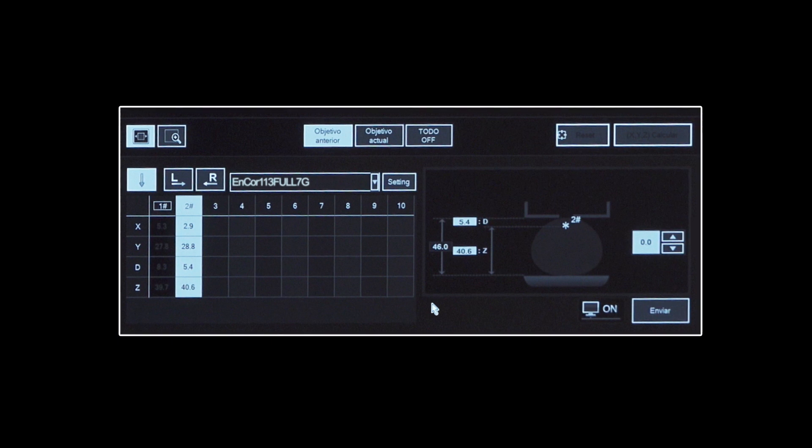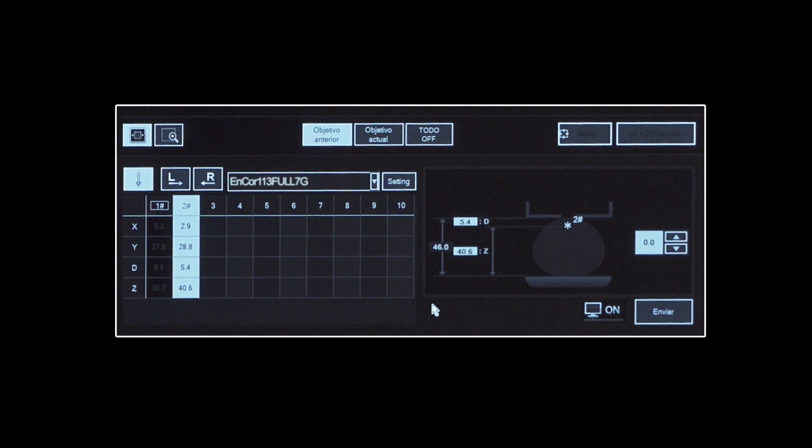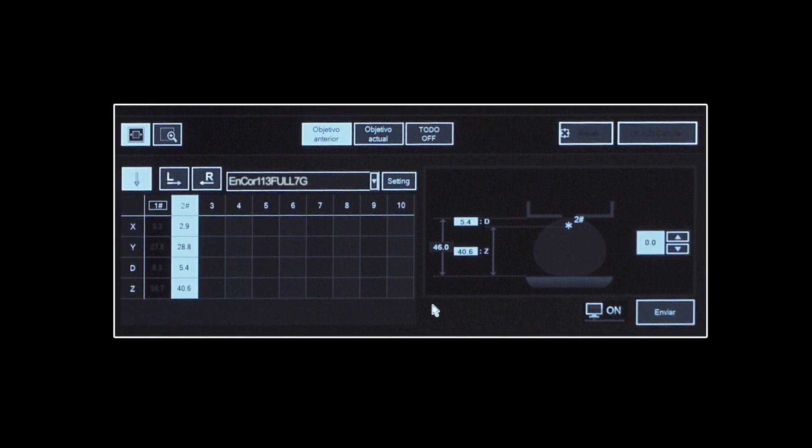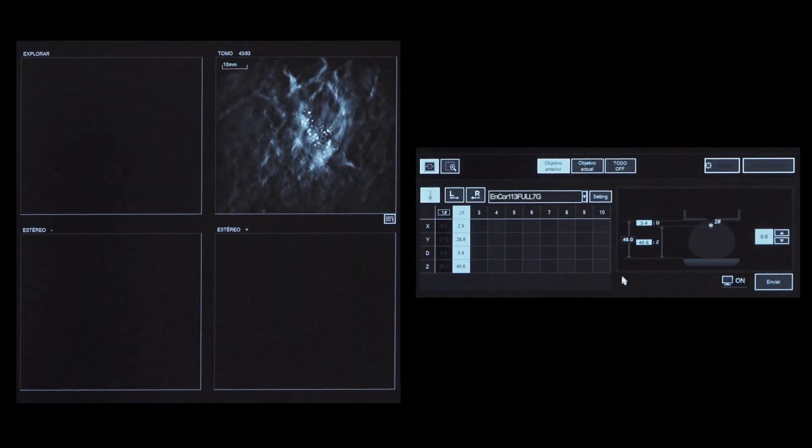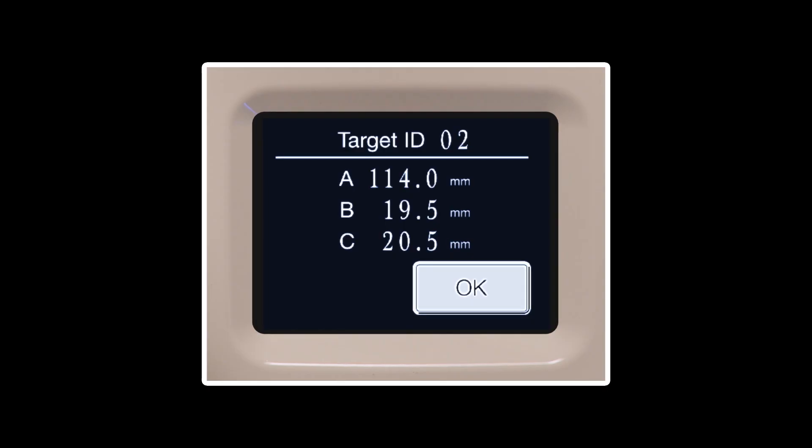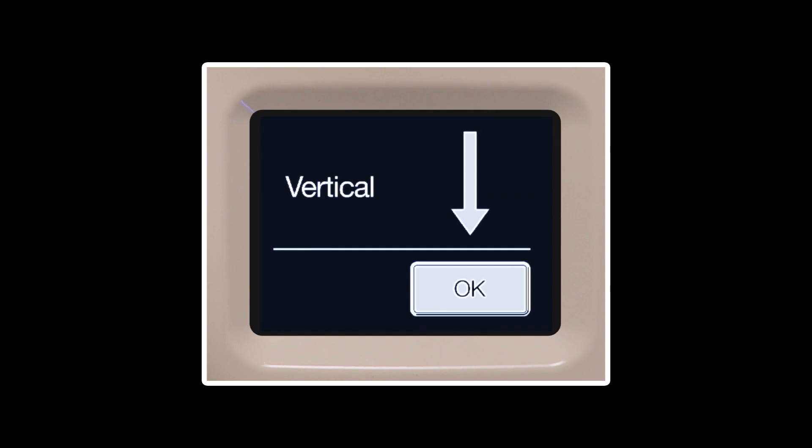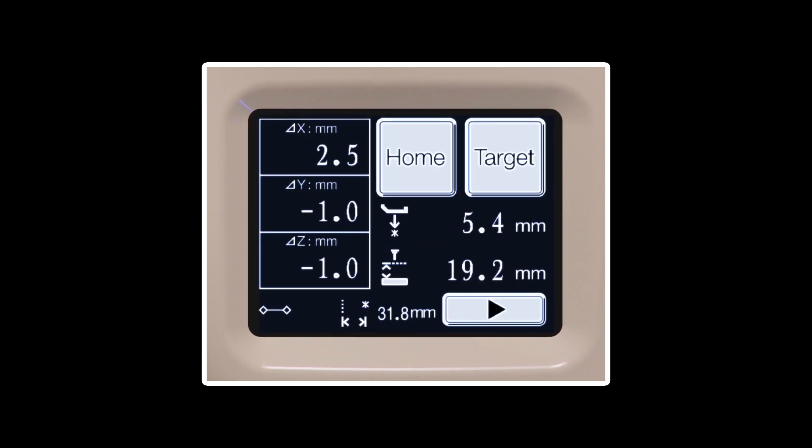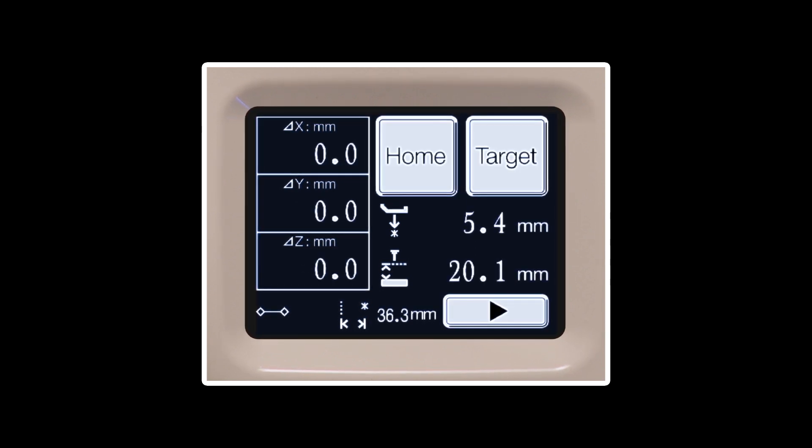It is decided to use NCORE 113 full notch 7G needle, since the procedure can be completed with a smaller number of samples. Needle is selected and values confirmed. Click the Send button to send coordinates and needle characteristics to the biopsy positioner. Confirm target ID and needle characteristics. Confirm vertical approach. The target information is displayed. Press the target button to drive the needle holder to the selected target coordinates.